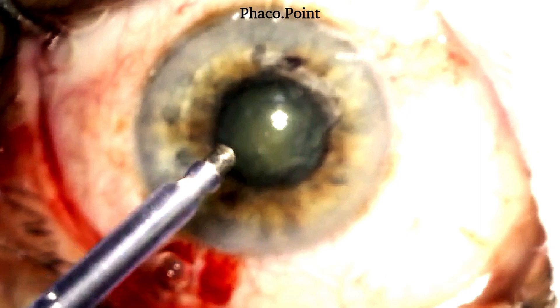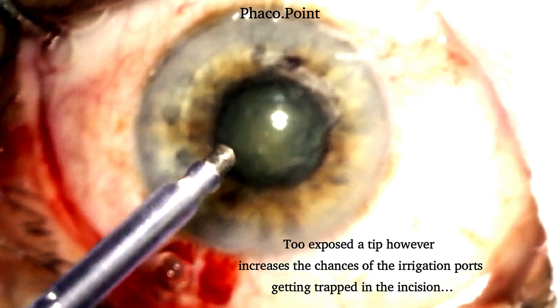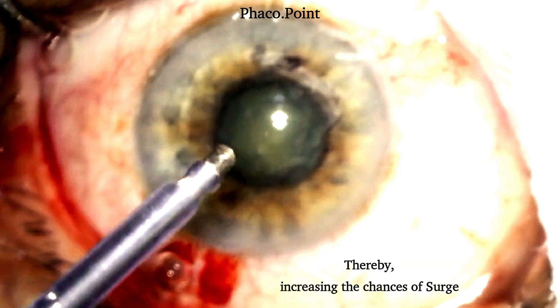However, you don't want the tip to be overexposed either, because in a patient with a small pupil, you are going to be emulsifying the fragments in the anterior chamber. Too exposed a tip can result in the irrigation ports of the sleeve getting caught in the incision or coming out of the wound, resulting in an unwanted surge. So it's important to plan how much you want to expose the tip.